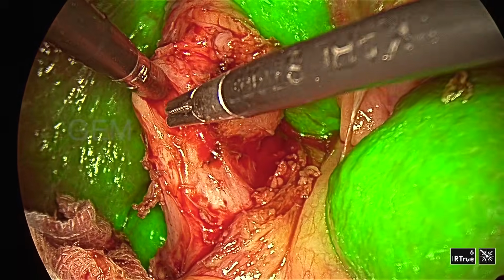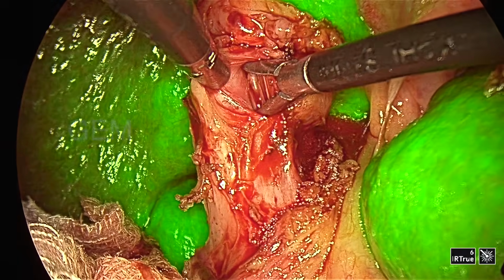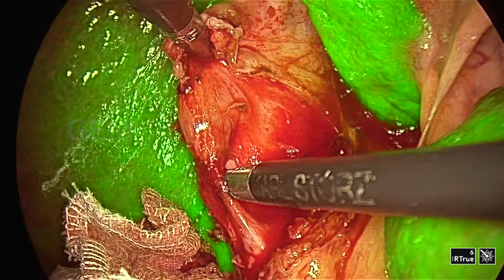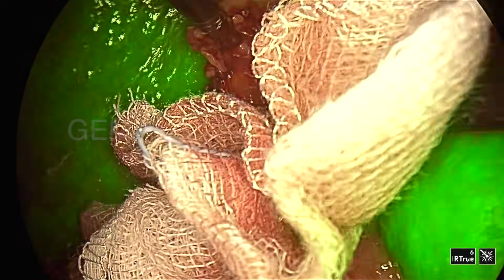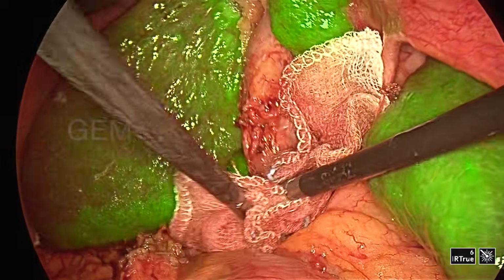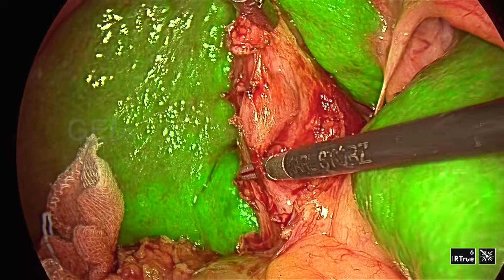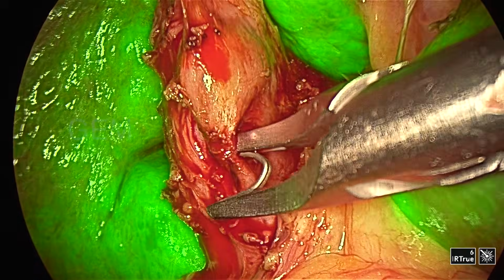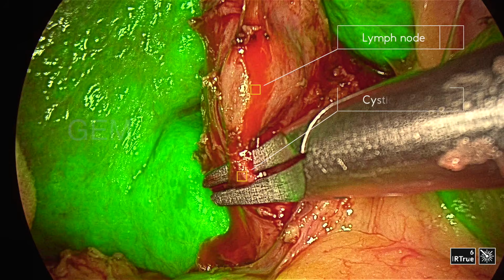Basically that is the infundibulocystic junction, and here I cannot divide the cystic duct at the infundibulocystic junction, which is normally the safety zone, because in this case the stone is at the cystic duct CBD junction, and the cystic duct is very long with a low insertion to the CBD, going to the suprapancreatic level.